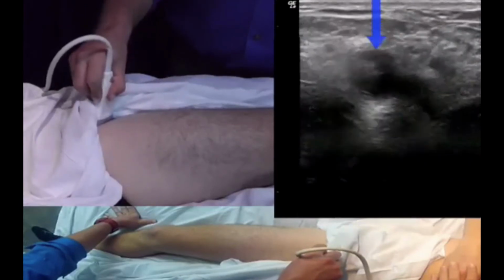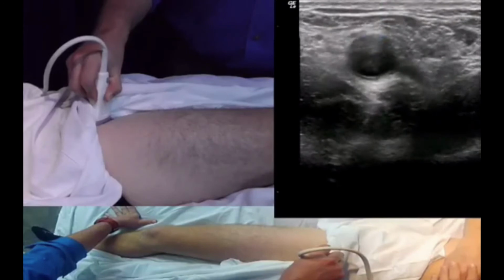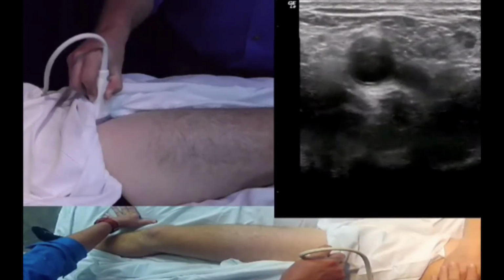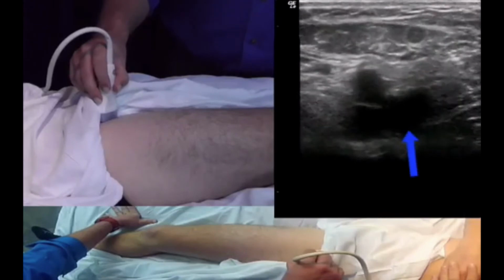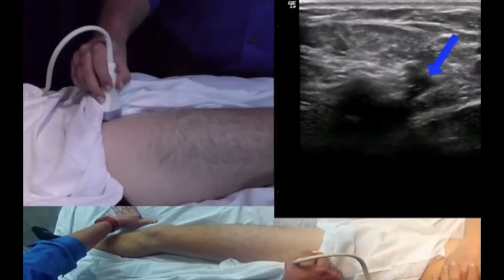Femoral artery can be seen here. It's a pulsatile structure when you apply light pressure. As you relax, you'll see the common femoral vein. The common femoral vein is here, and you will need to slide up or down the leg until you see the saphenous vein join. You can see the saphenous vein right here.